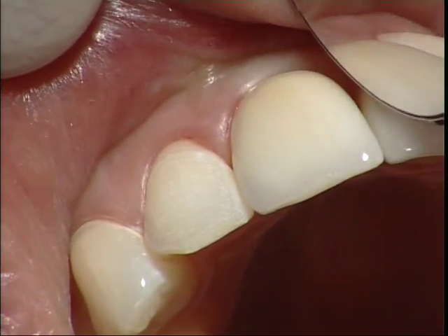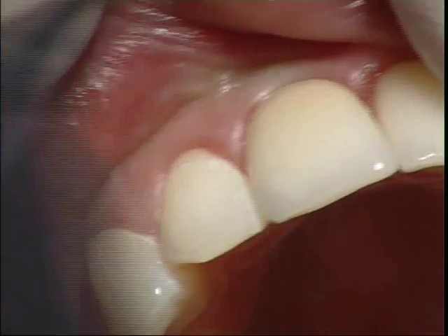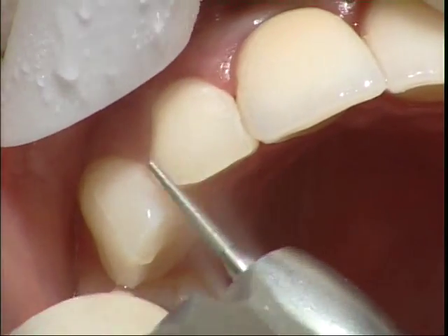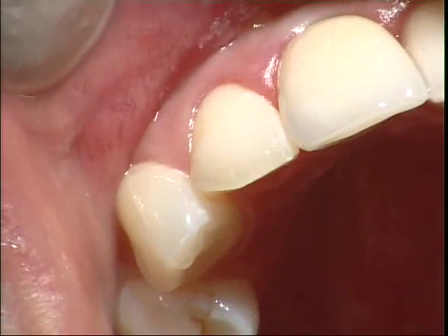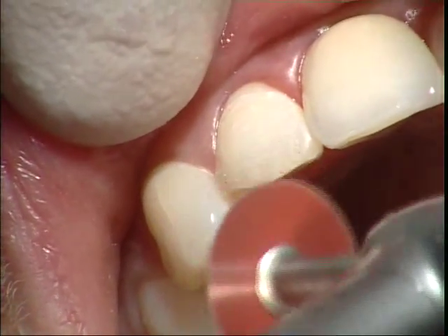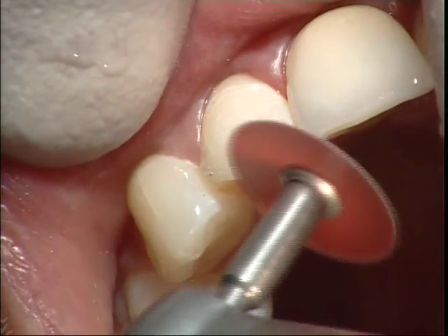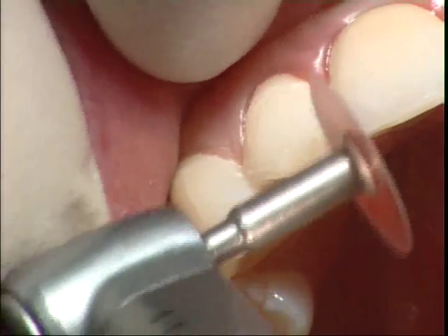It is all in enamel naturally. The incisal reduction is just very minimal since the tooth is going to be lengthened a little bit. But still, we are always doing a slight incisal reduction. The reason is, when you are seating this veneer, it is very hard to seat it perfectly without having an indication beyond just the buccal surface of the preparation. You need the incisal edge in porcelain to have a definite seating position. Here we are using the 3M paper discs for rounding off the incisal edge. And that is the finished incisal reduction.